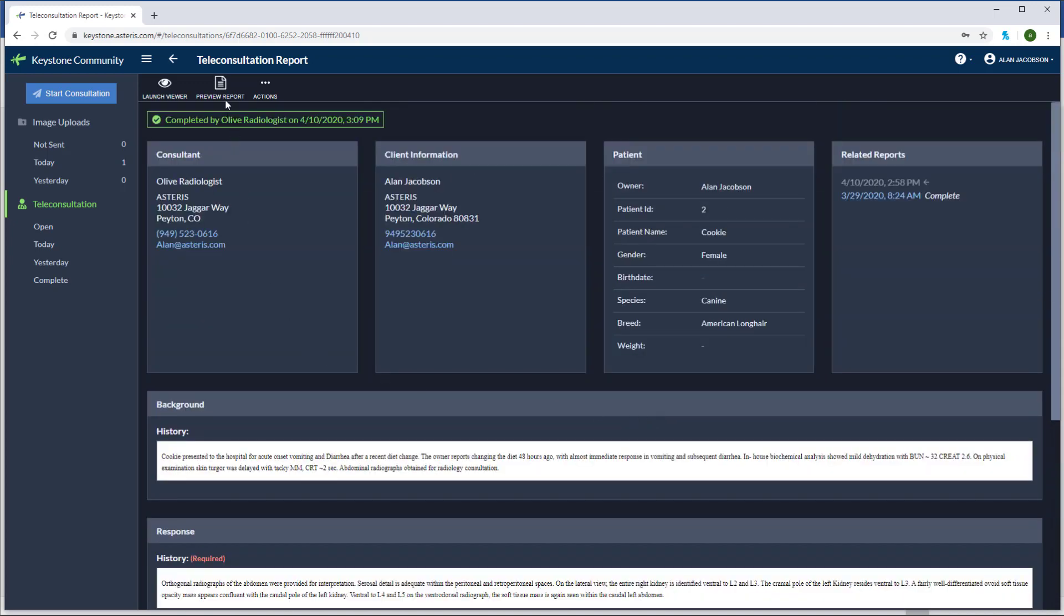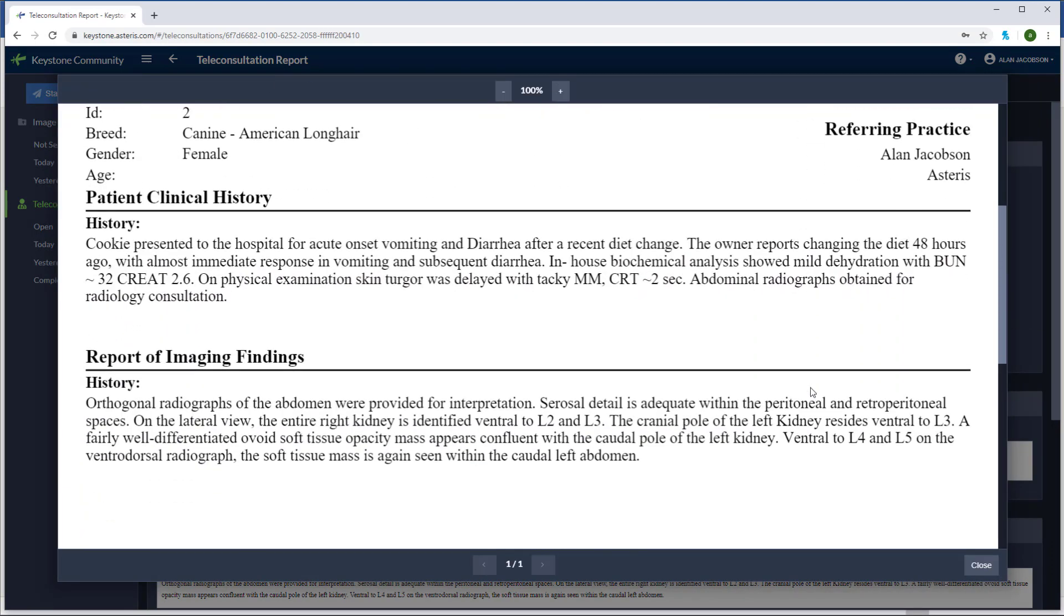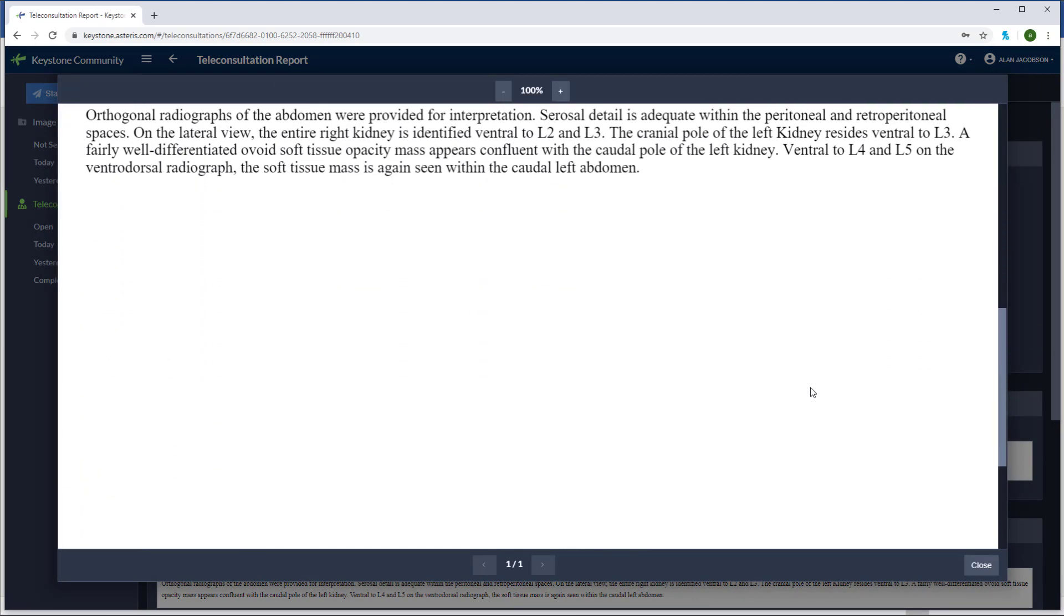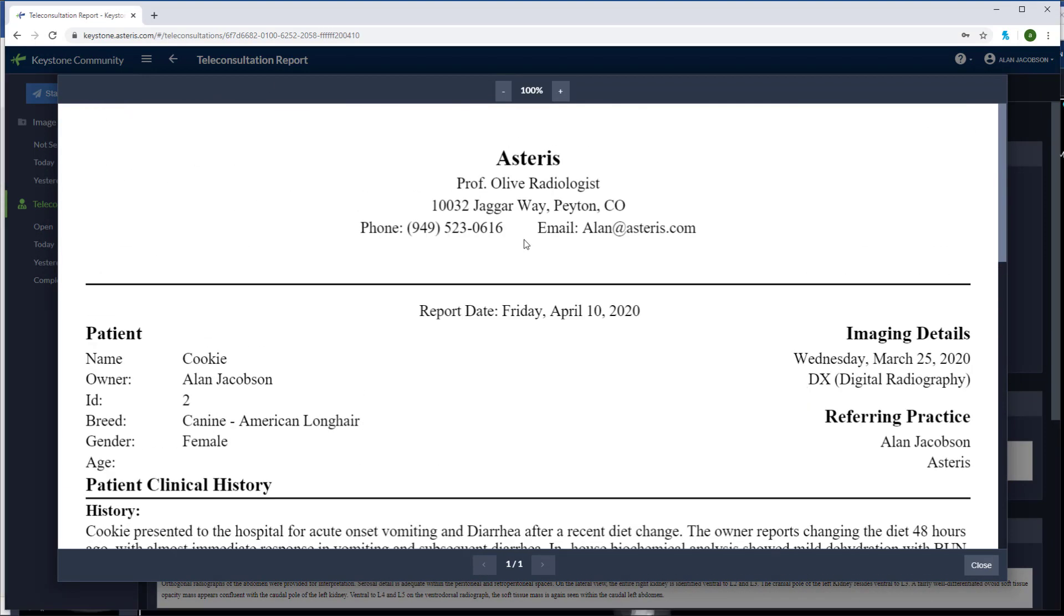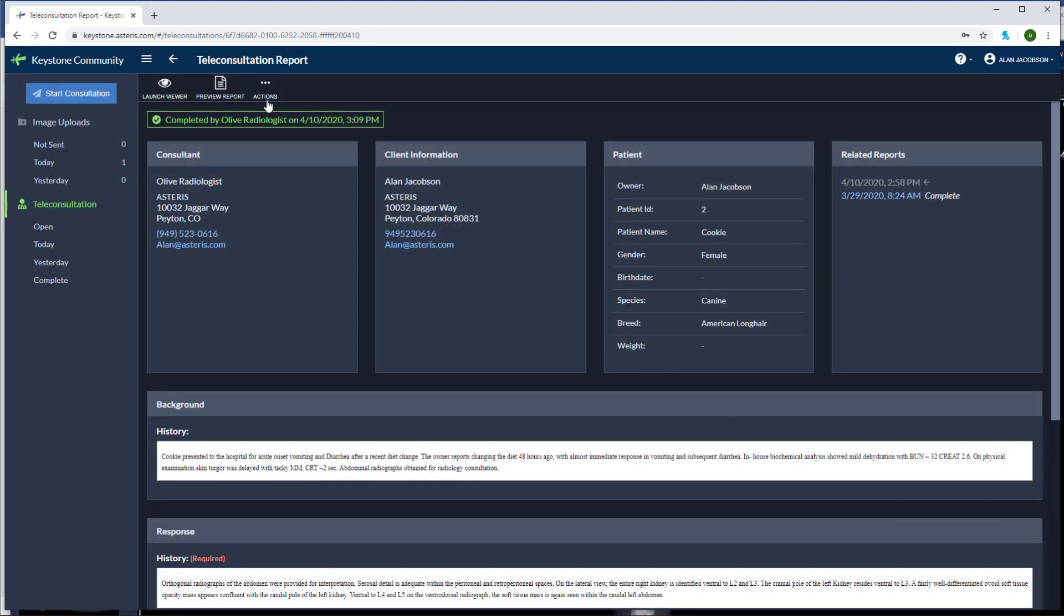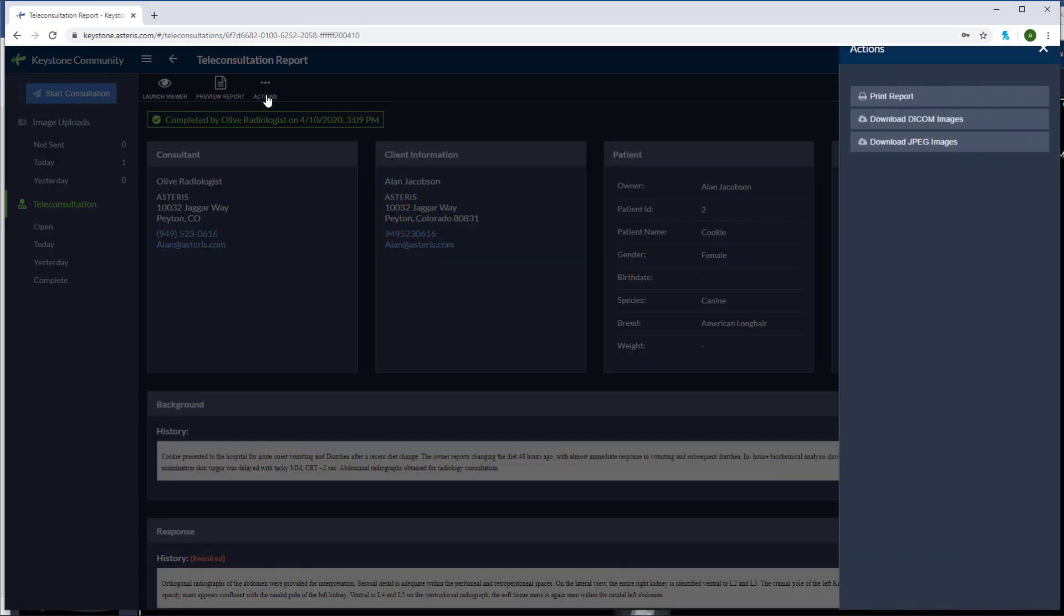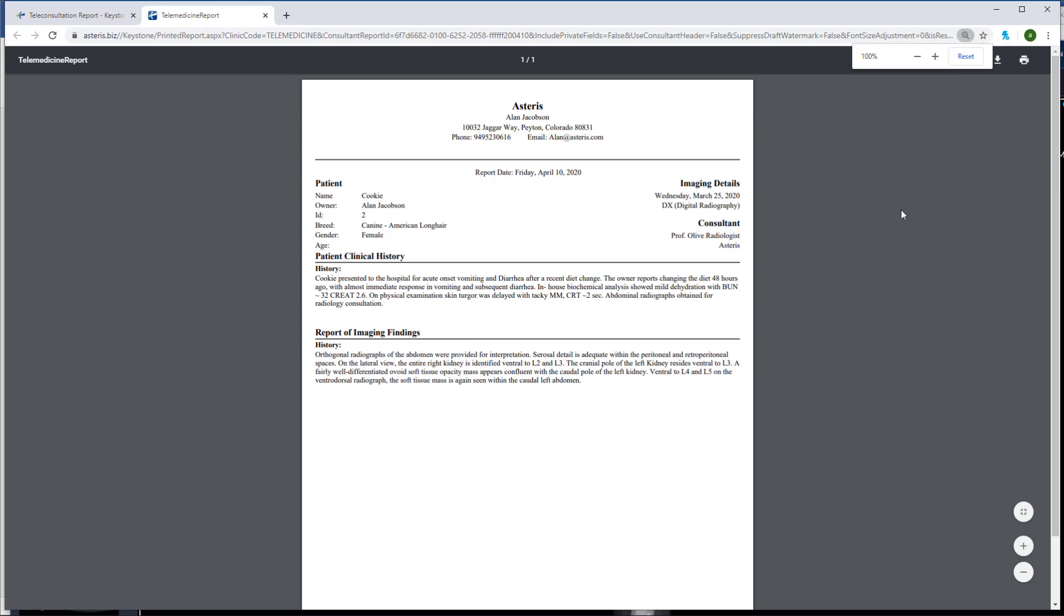If you'd like, you can preview the report in PDF format. If you'd like to print the report, go to the actions tab and select print report. You can select show watermark, use consultant headers, or include any private fields if you'd like. Now I can easily print out my radiology report.